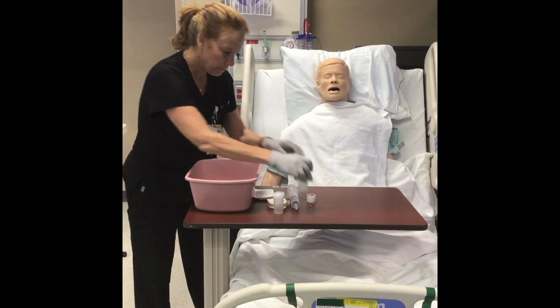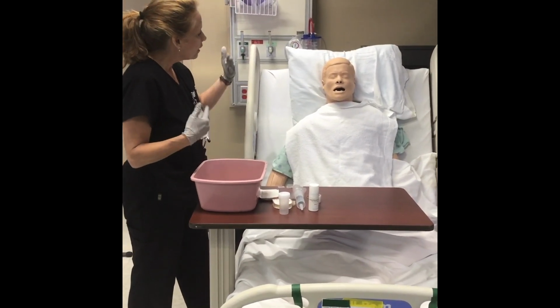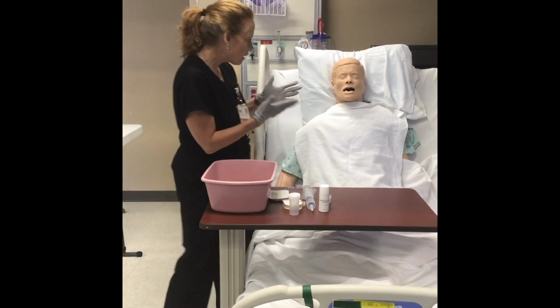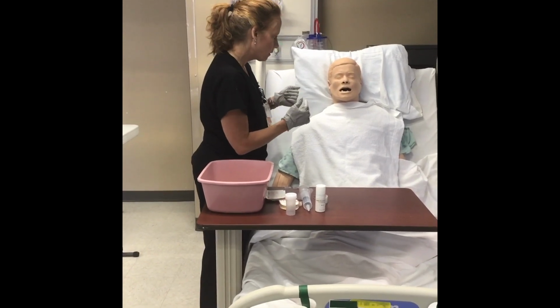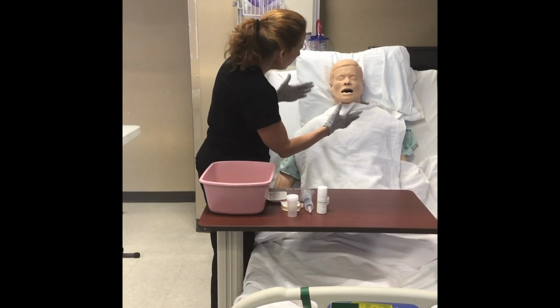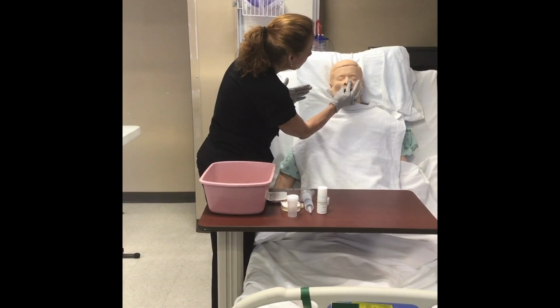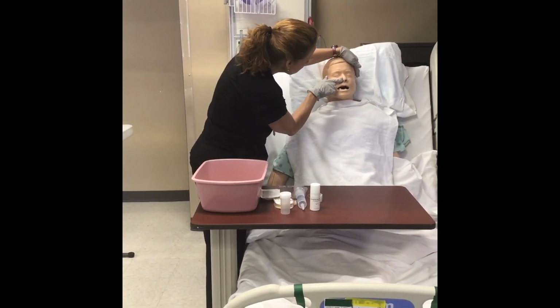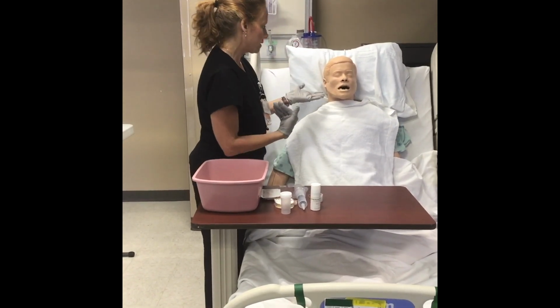Now the next thing I'm going to do is I'm going to check for patency in your nostrils. Do you have a side that you prefer? Have you had any surgery that I need to know about? I've not had any surgery, and you can choose which side. Okay, so if you don't mind, I'm just going to occlude one of your nostrils. Can you breathe out? Okay. Whoops. And I'm going to occlude this nostril. Any preference? Otherwise, I'm going to go on the right side.